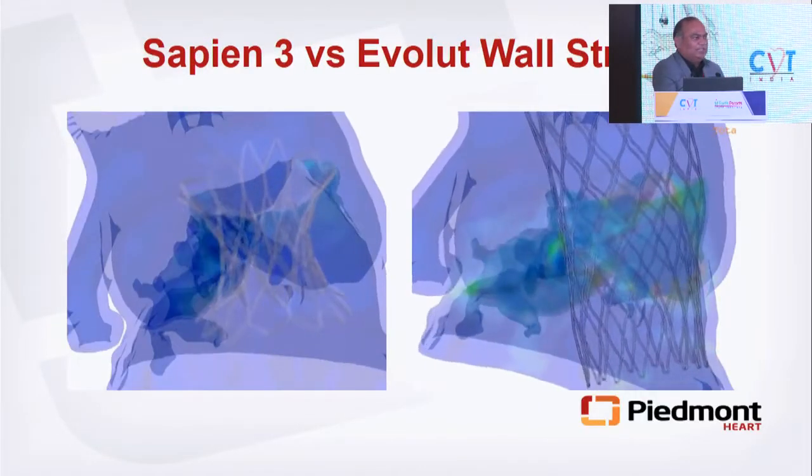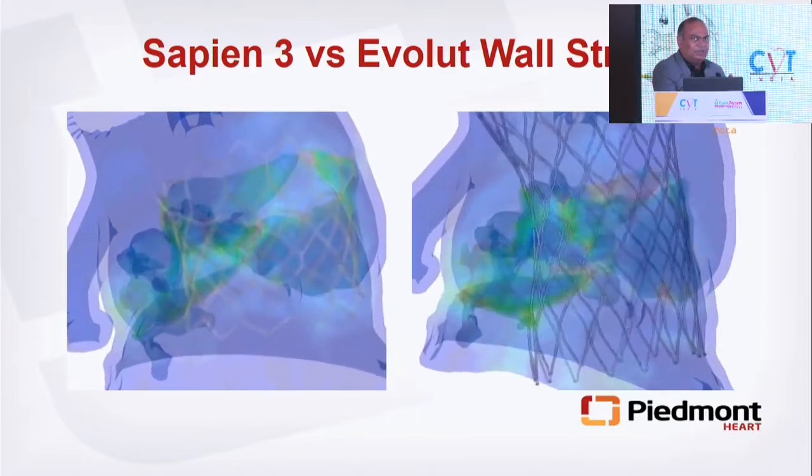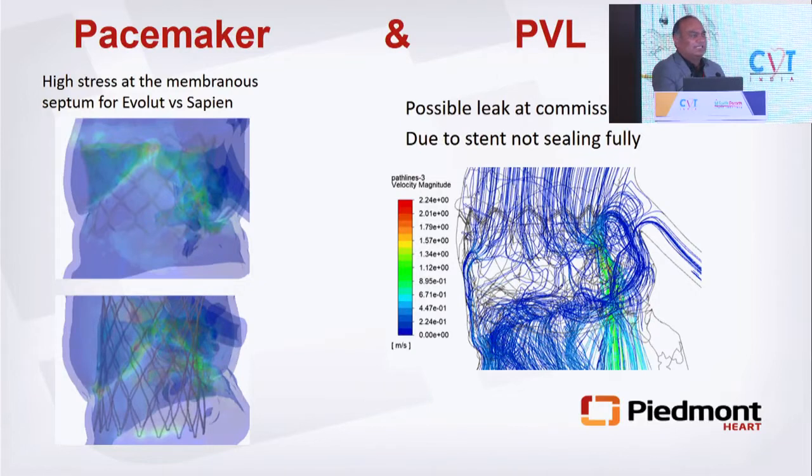We went ahead and did a simulation that we're developing with our Georgia Tech partners just to understand what's going to happen to the calcium. And you can see that both platforms push that calcium towards the left coronary. Big chunk all gets pushed to the side. And then, as the next step, we assessed the wall stress on the aorta. This wall stress is in megapascals, and you can see in the middle picture, if it's a 29 nominal deployment, wall stress is 0.65 megapascals, and the threshold for annular rupture on this software is around 1. So we're feeling very good that, despite the calcium moving all to one side, we will not have a rupture. You can also assess pacemaker and PVL risk for these cases. On the software, you can see very little green here, so this should give only mild PVL.